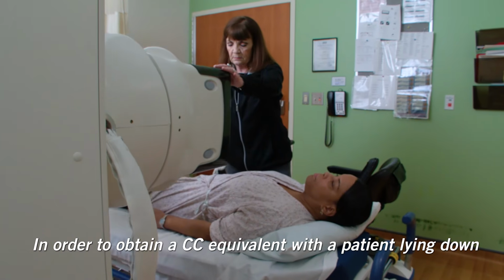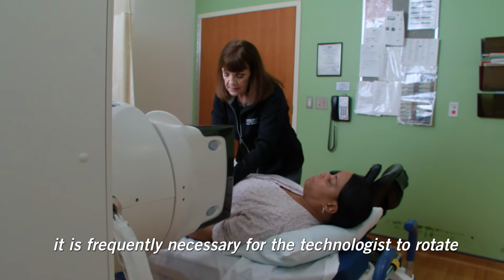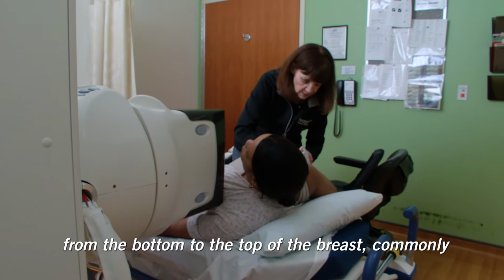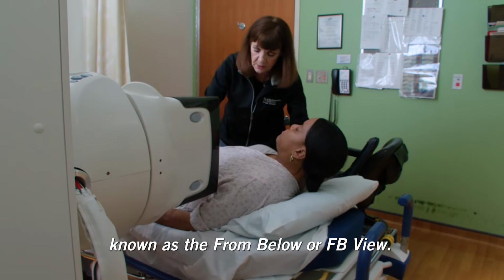In order to obtain a CC equivalent with a patient lying down, it is frequently necessary for the technologist to rotate the X-ray tube and detector, with the imaging being performed from the bottom to the top of the breast, commonly known as the from below or FB view.